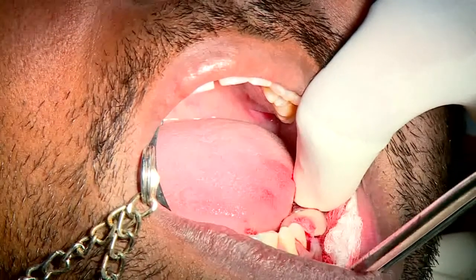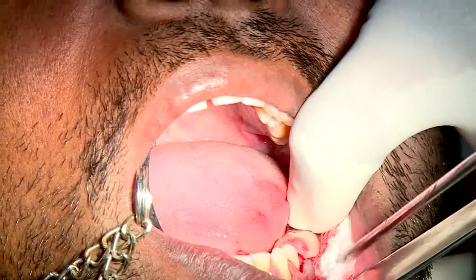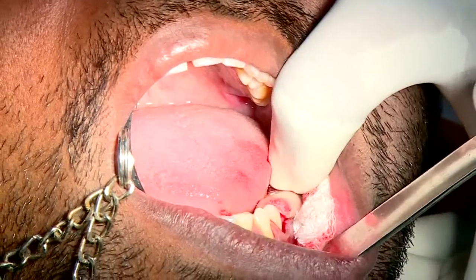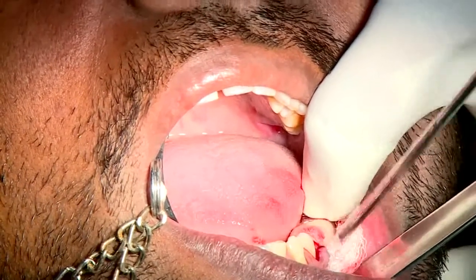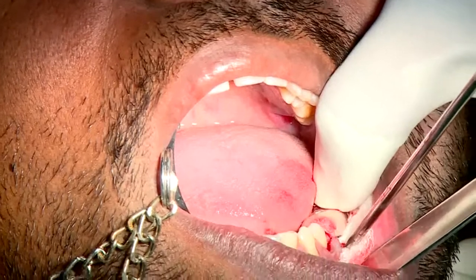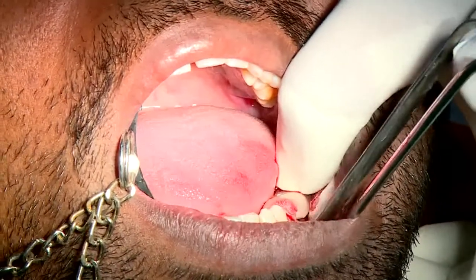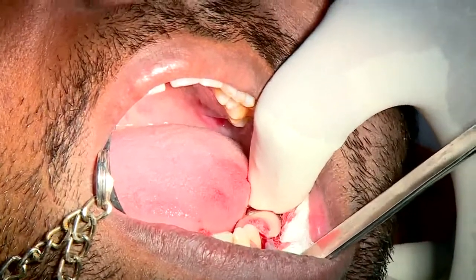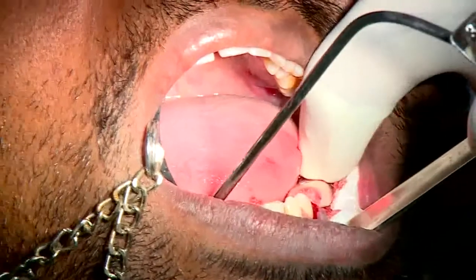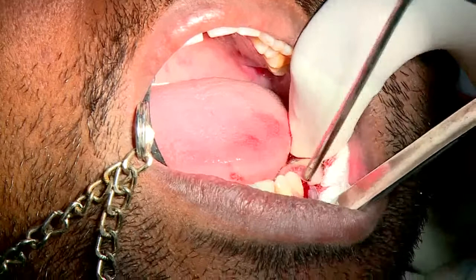In simple ways, you can have a fixed replacement when somebody is missing a tooth by either sharing the load on the neighboring teeth, or you put the load on the underlying bone. So all we are doing here is putting a foundation on the underlying bone. The bone should be able to take that position, but more importantly, it has to go in a position where the tooth can be restored.